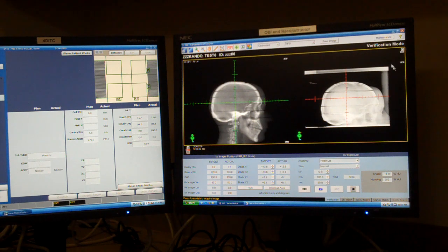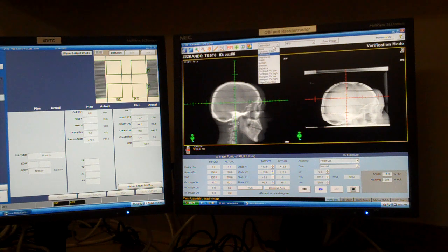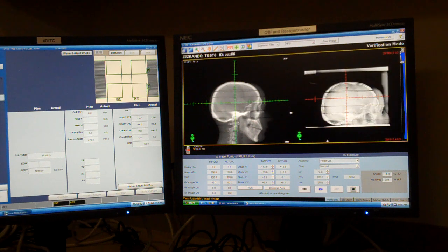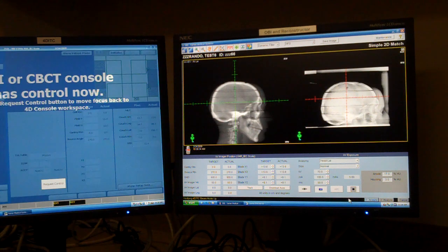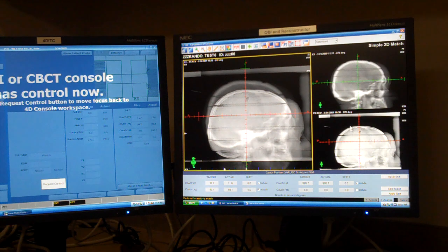From here, I can adjust my window level to look like my DRR. I can go into Dynamic Filter, which is about the same as the AHE in Mosaic. When I'm happy, I'll click 2D Match, then Analyze, and you can already see I'm quite a bit off.